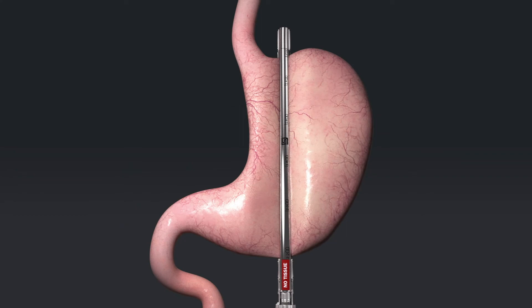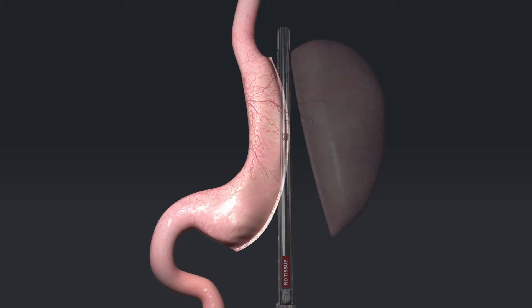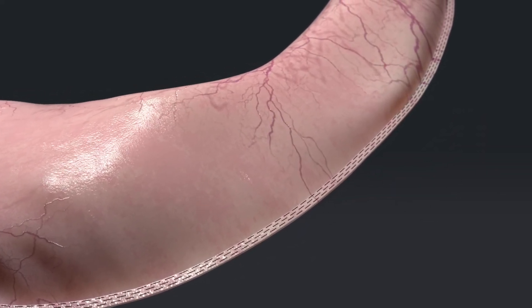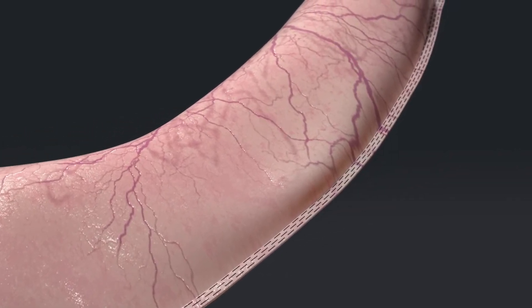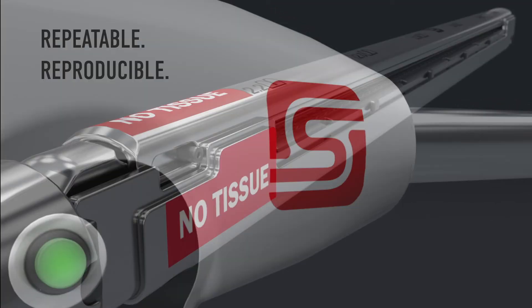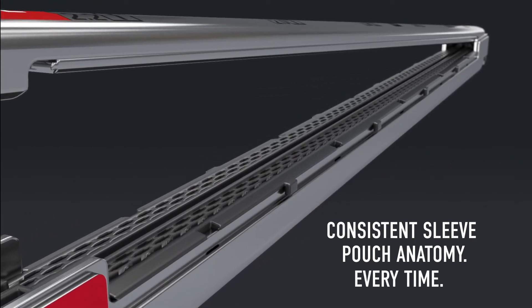After firing the Titan SGS, the resected stomach falls away and the new stomach rebounds, revealing a more symmetrical and reproducible sleeve pouch anatomy. The curved staple line is a continuous staple line, free from zigzags, overlapping, or poorly formed staples. The Titan SGS enables surgeons to plan for a more repeatable and reproducible procedure that delivers consistent sleeve pouch anatomy every time.